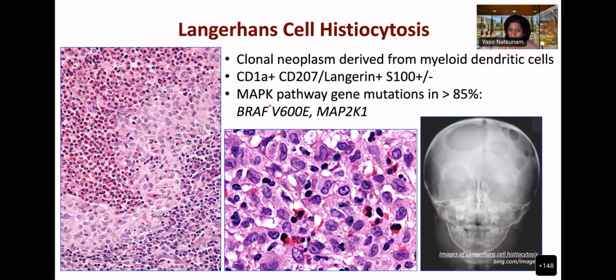This is where confirming with your BRAF mutation-specific antibody helps. Is that available, Sumit? Yeah, BRAF is available in few centers. Yes. So confirming if you're not sure is important. If the patient has a history of skin rash, that could be very helpful. Finding melanin pigment can be very helpful in dermatopathic lymphadenopathy. Sometimes it's not the majority of the cases, you can differentiate them more easily. But CD1A, Langerin, S100 can all overlap. So the newer markers are very helpful.